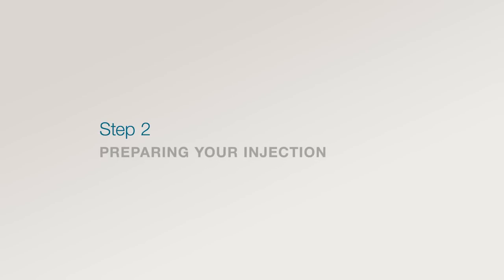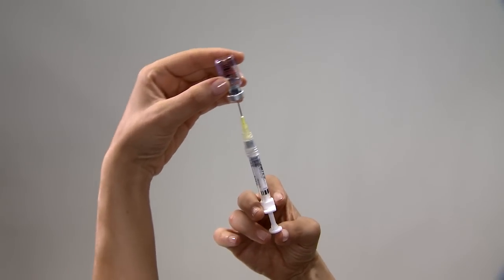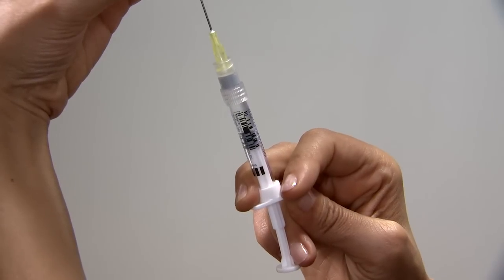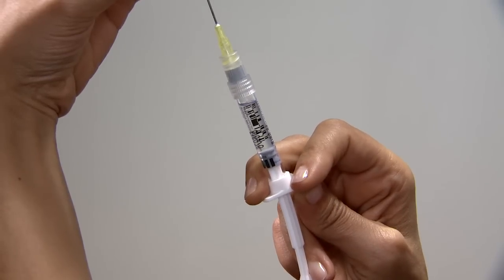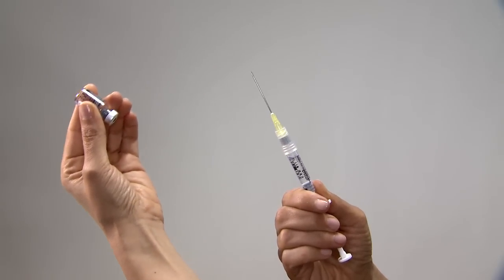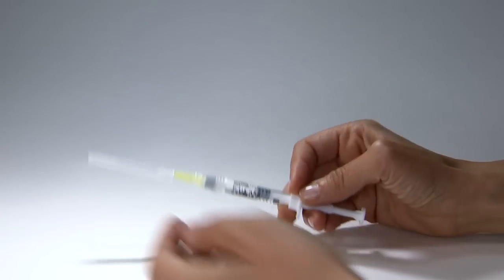Step 2: Preparing your injection. Keep the needle inside the vial as you lift the vial and turn it upside down with the needle pointing upward. Slowly pull back the plunger until the syringe fills with the total contents of the vial. Carefully remove the syringe needle from the vial. It is important to withdraw the entire contents of the vial. Recap the syringe needle.